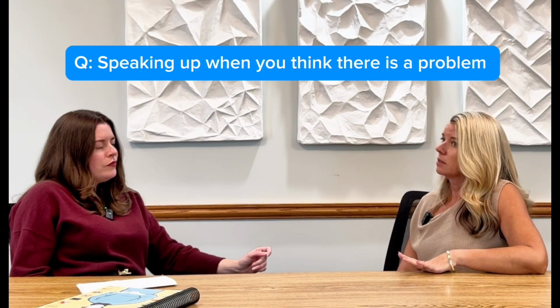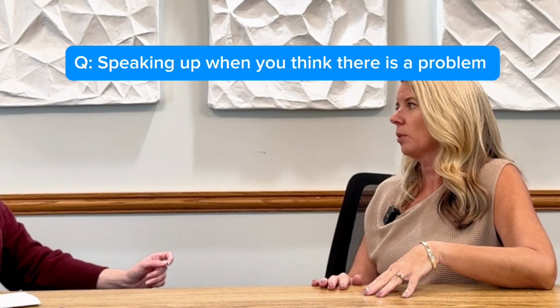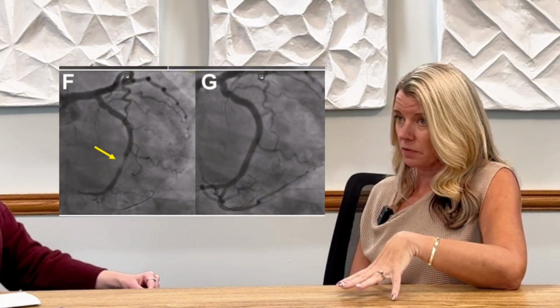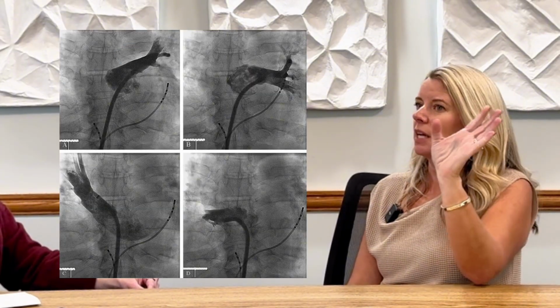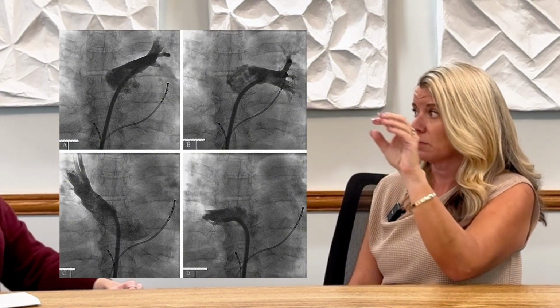Because, for example, you could be looking at intracardiacs and they all look completely normal. But if you look at your surface, you could have an ST segment elevation. It's not going to show in your intracardiacs. Why do I use that example? Because it happened to me when I was fairly new, back when we did AFib ablations and we actually ablated inside the pulmonary veins with a 4 millimeter tip ablation catheter. We would take a venogram of each pulmonary vein to prove that it was patent.